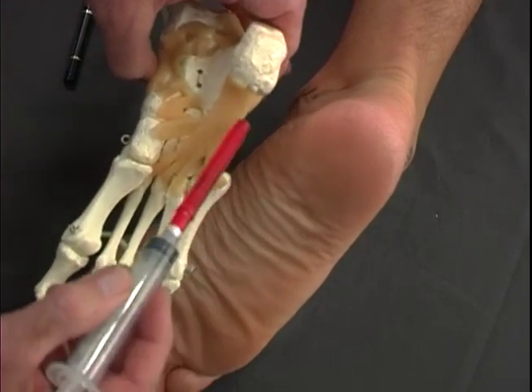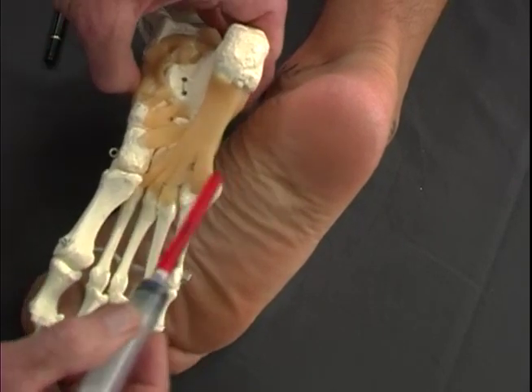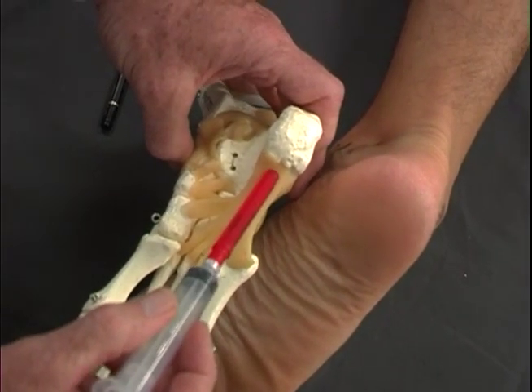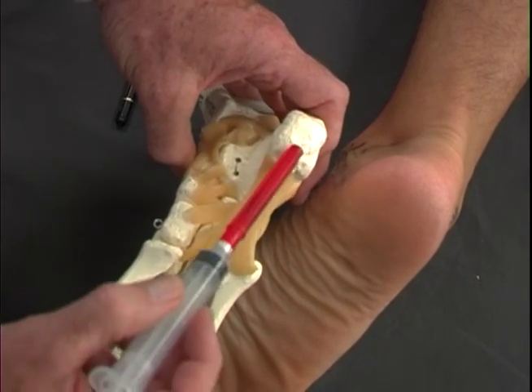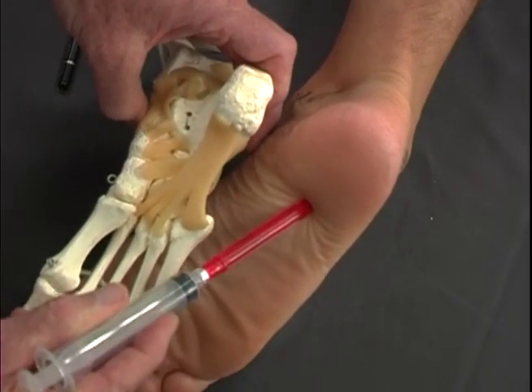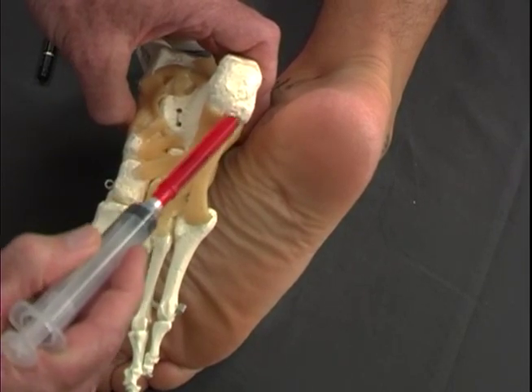I numb this well with xylocaine, not only in the skin, but deeper in as well. I then come in directly, aiming back for the posterior portion of the calcaneus where it tips forward. So we're coming in this direction, and usually I'll redirect my needle 2 or 3 times and pepper this area with a small amount of solution.